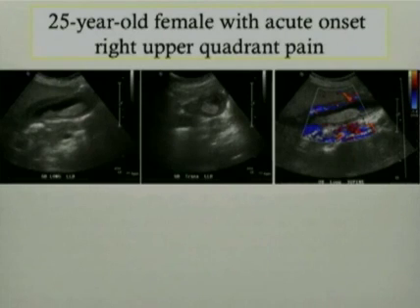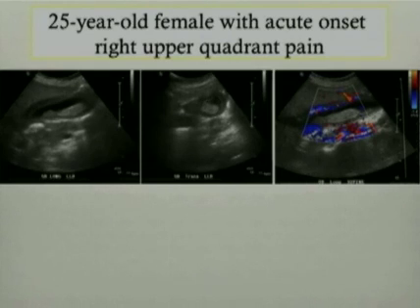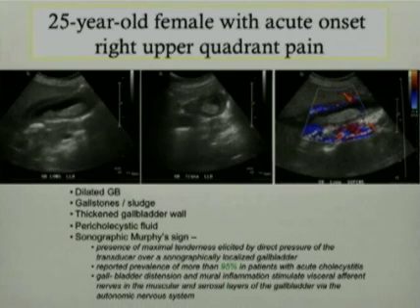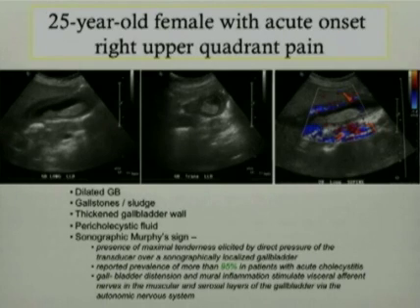This is the first case of a 25-year-old female who presented with acute onset right upper quadrant pain. The three sonographic pictures presented here demonstrate a very classical picture of acute cholecystitis. It demonstrates a distended gallbladder, some gallstones and gallsludge, a very thickened gallbladder wall, some pericholecystic fluid. What we are not able to demonstrate here but is extremely important in making the diagnosis of acute cholecystitis is that of sonographic Murphy's sign.